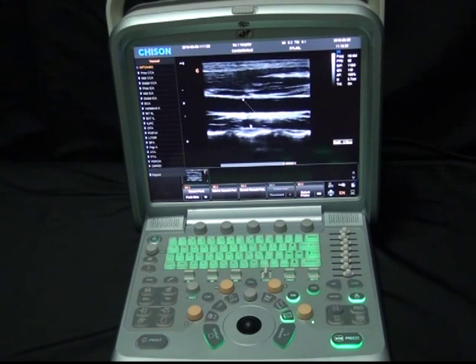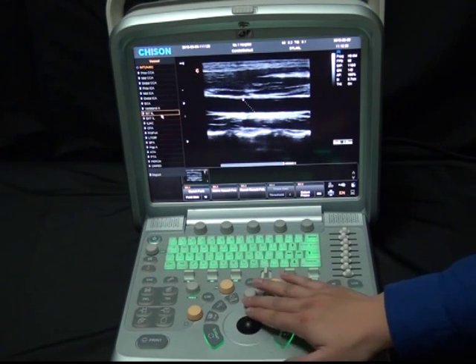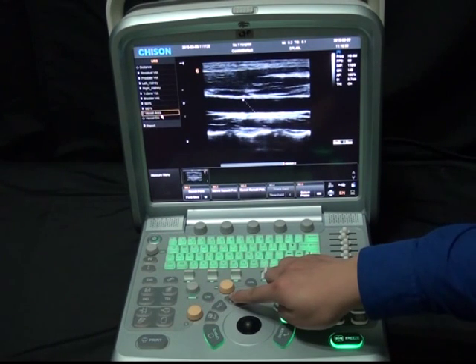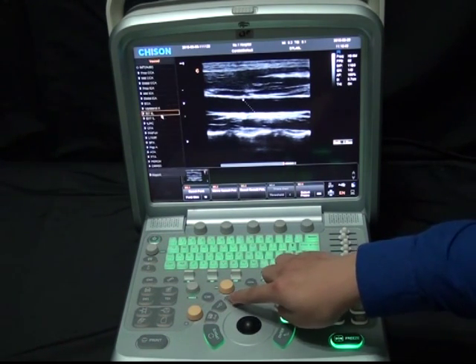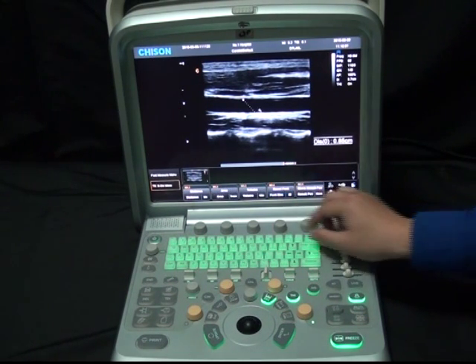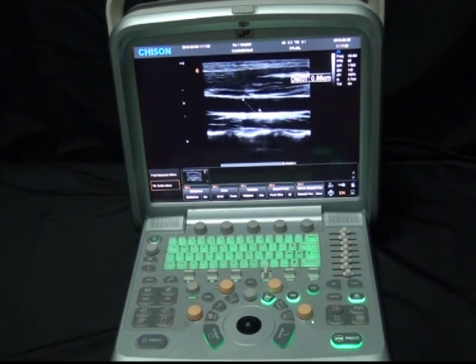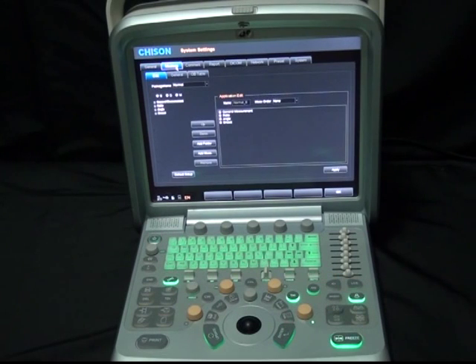If you want to do professional measurement, hit Calc. We have our calc package — here it shows vessel, with all vessel calculations available. Press Change to switch the calc package. We have URO, small parts, pediatrics, carotid, cardiac, abdomen, GYN, and OB. It is worth mentioning that we can adjust the font size and position for the result. We can also do user-defined calculation packages — press the Setup key to choose measurement. In this interface, you can add or delete calc items.